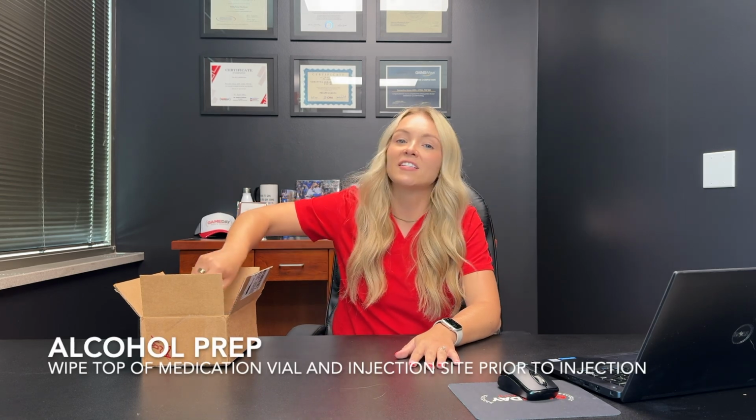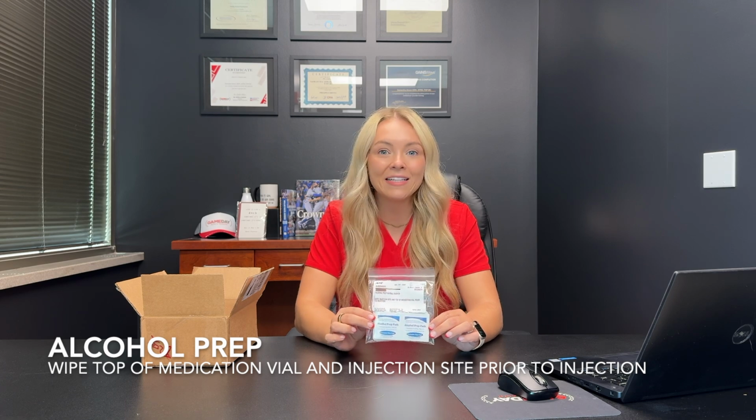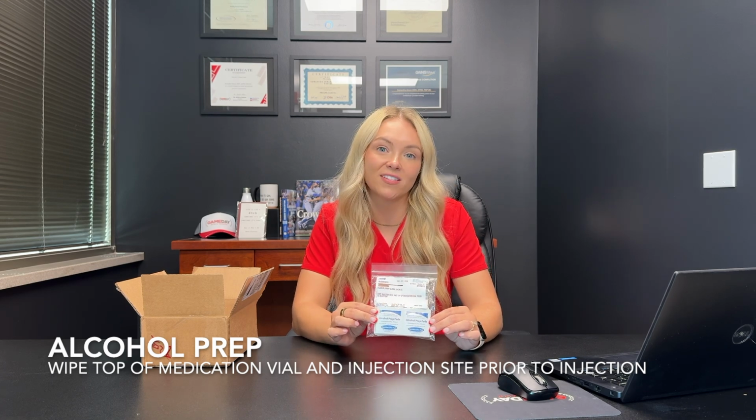Your medication and injection supplies will come in a box, kind of like this one, approximately 1 to 2 weeks after your prescription order has been placed. When you open your box, you're gonna find multiple different baggies with the supplies that we've ordered for you inside them. On each of the baggies is a label that tells you exactly what's inside the baggie and what it's used for. When you open your box, first you're gonna find alcohol swabs. The alcohol swabs are used to clean the top of the medication vial. They're also used to clean the skin above where you plan to inject.